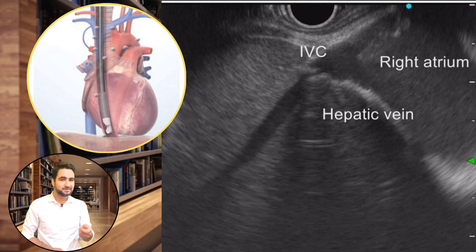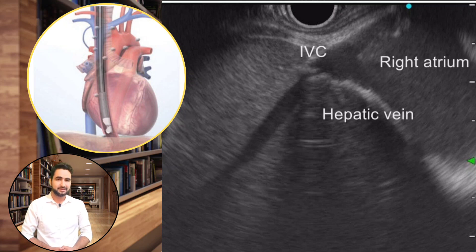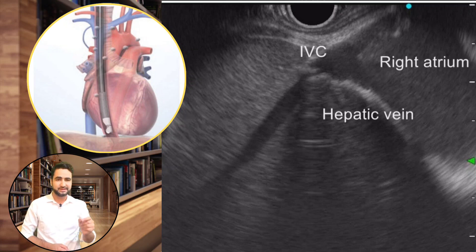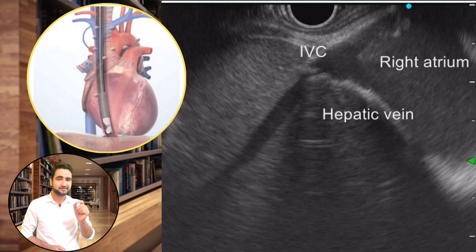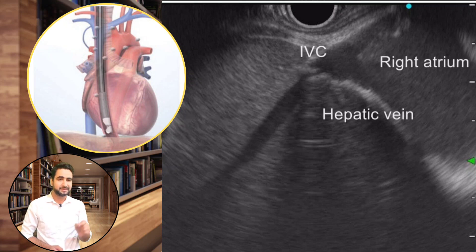Turn the scope counterclockwise to image the left hepatic lobe and left hepatic vein. This setup has also been discussed in my previous videos. You can now easily identify the left hepatic vein while slowly withdrawing the scope. You can follow the left hepatic vein entering into the inferior vena cava.